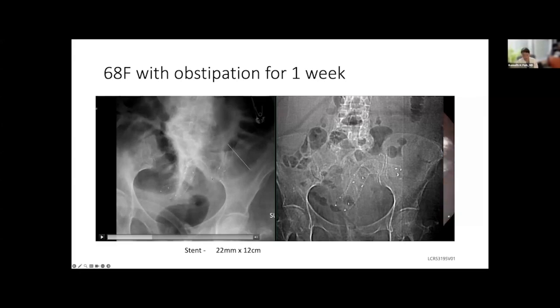Normally true, but knowing that I'm placing a very low axial force stent, I felt pretty comfortable placing the stent. Again, from those first few slides comparing the axial force, the force that the stent exerts to straighten out is almost near zero for these types of stents. So I felt comfortable placing it.